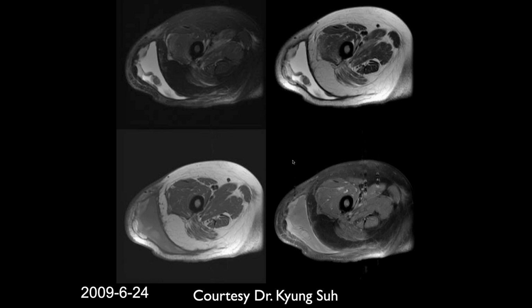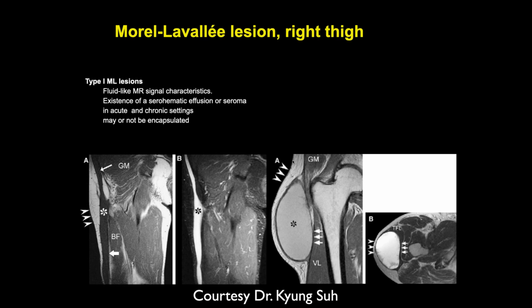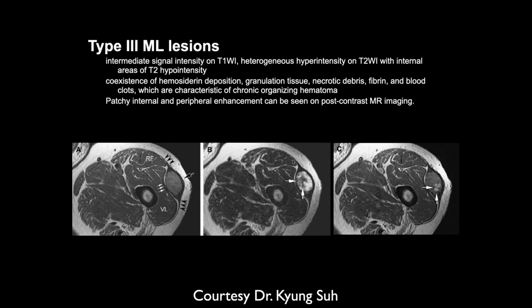And so we see this large fluid collection on a somewhat deeper fascial layer with heterogeneous signal within it. So this is concerning for an internal shear injury, like a Morel-Lavallée lesion. And there are different grades of these, which I've never really talked about in a clinical setting. But I think we talked about treatment, haven't we, John? Why don't you talk about treatment, John?